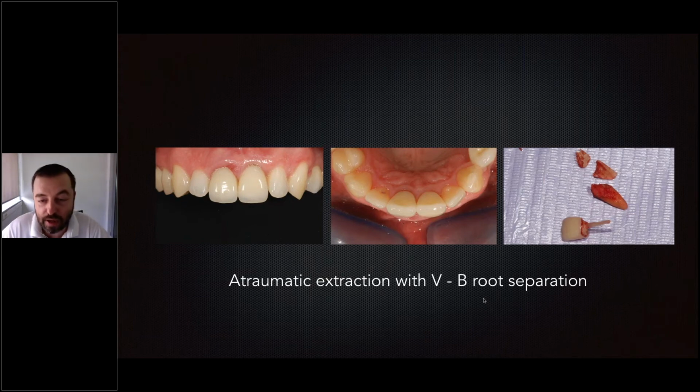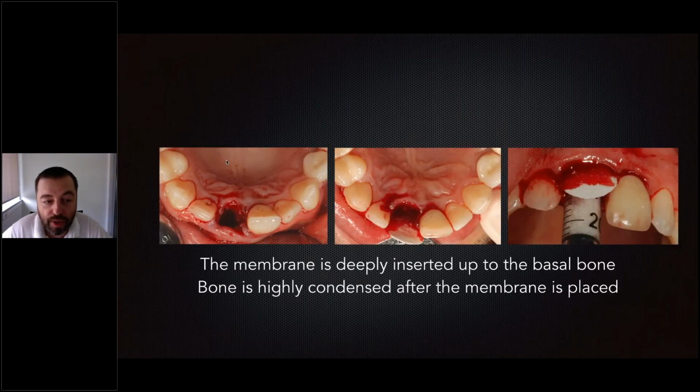body touch. And one of these body touches generated some destruction of this root. So he had a fight, and he had a fracture of tooth 1-1 about 3.5 years ago. Because he did not come immediately to our office, there was micro movement, and the bacteria were allowed to destroy a little bit more of the buccal bone. So he had no buccal bone. We were not able to insert the implant immediately.